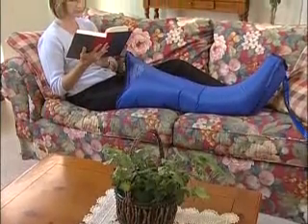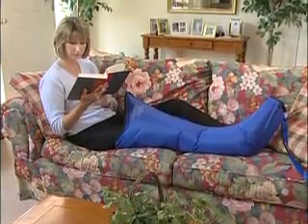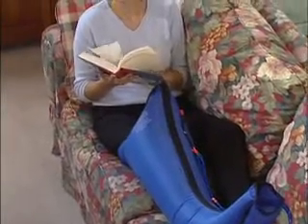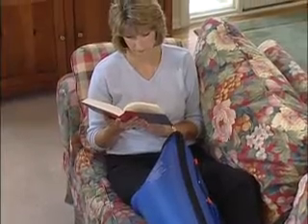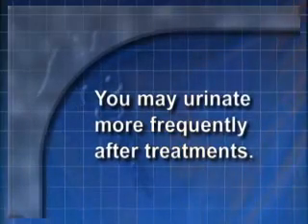In cases where you have had surgical removal of lymph nodes, or are experiencing inhibited lymphatic or venous circulation, or if you have had inadequate functioning of the valves and pumps in the calf and foot area of your leg when walking, or due to long periods of immobility, the sequential circulator pump must act as a form of compensation. As a result, circulation is often improved along with removal of excess fluid and a decrease in swelling. Because of this, you may find that you need to urinate more frequently after treatments.